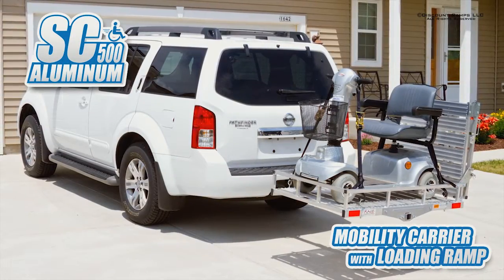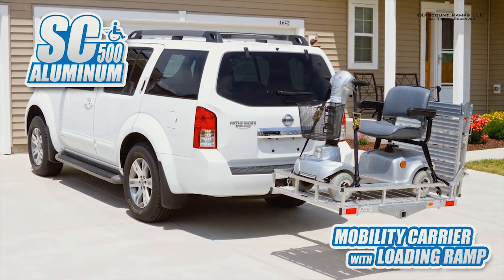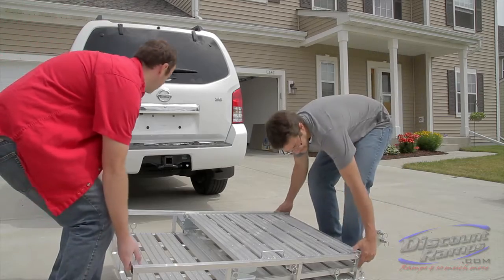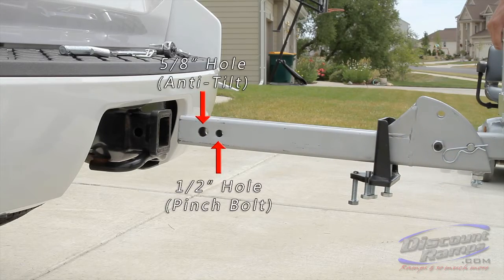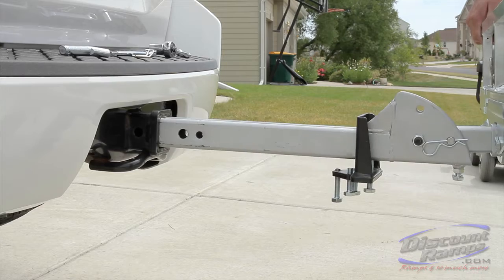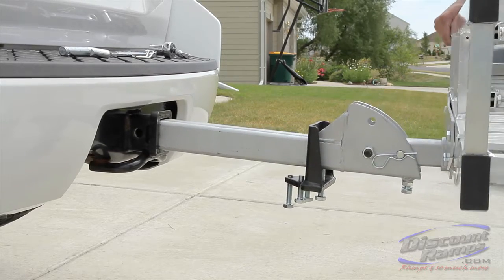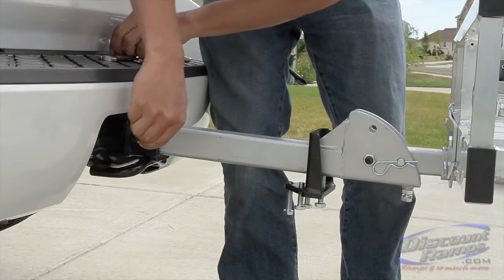Today we're showing you how to properly install the SC500AF Mobility Carrier from Rage Powersports. With another person to help, install the carrier and align the 5/8 inch hole on the main hitch tube with the vehicle's hitch pin hole. Install hitch pin and clip.